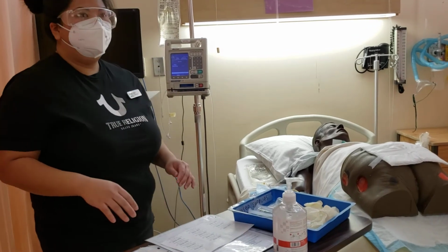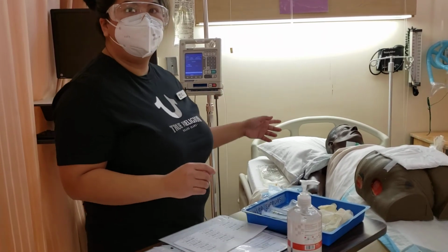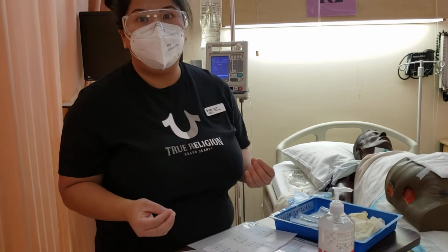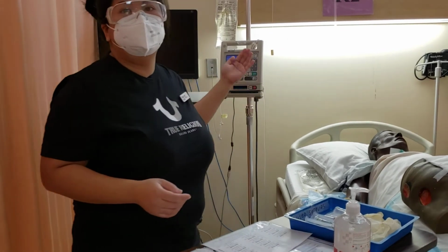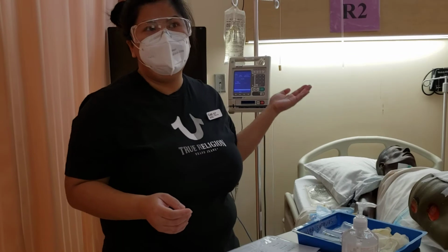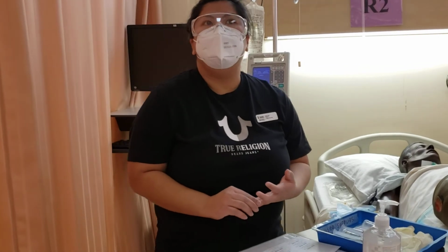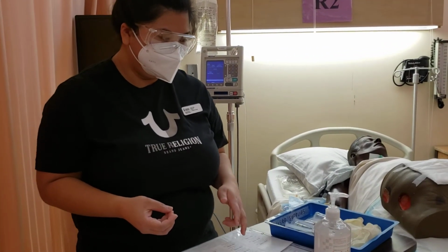If there is an infusion that's currently going in, which our patient has, we would stop the infusion and put the pump on standby. That way we can ensure that our blood sample will not be contaminated with the infusion that's going in. So the machine is now on standby. I had put it on standby in my previous attempt and I forgot to restart it. In real life, I would stop the infusion, put the machine on standby, and then wait for 2 to 5 minutes before I obtain my blood sample. Again, that way our blood sample will not be contaminated.